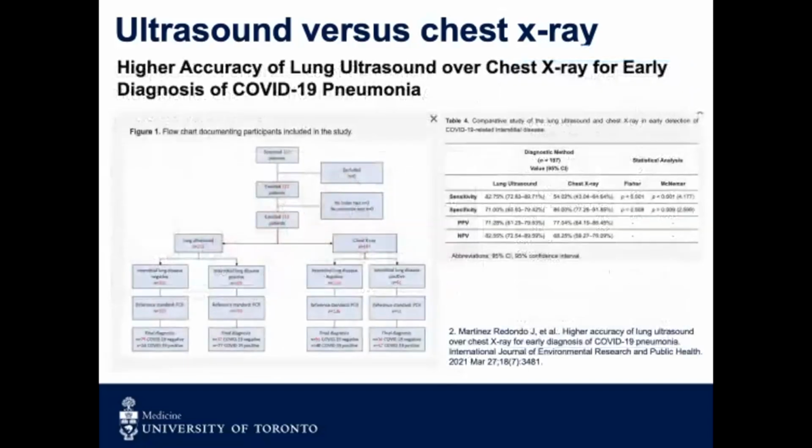So let's take it to a different study in Spain. So we're moving from Minneapolis to Spain here. This was a single observational descriptive study. It was retrospectively analyzed, and it was carried out in patients who presented to primary care centers in Spain during the COVID pandemic between March 2020 and September 2020.